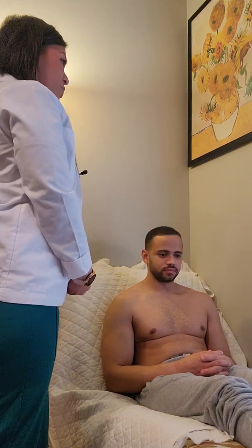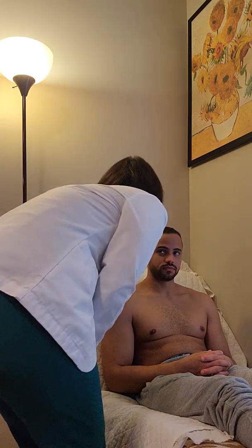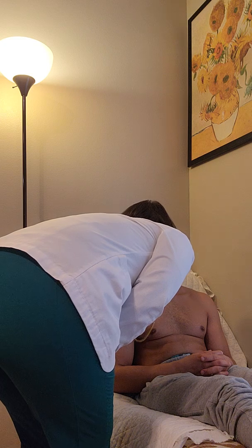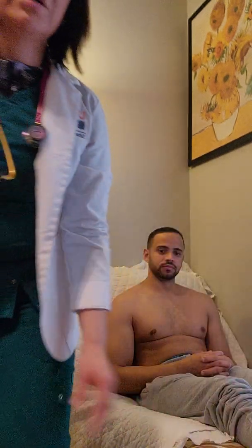Also, I'm going to check for retinal blood vessels. Can I look into your eyes? And this will, if there is any retinal blood vessels are bleeding, this usually will mean that there is some hypertension, changes in the vessels of the eyes.